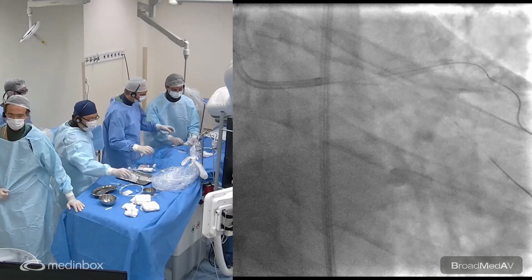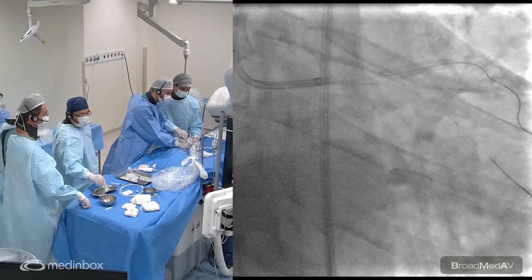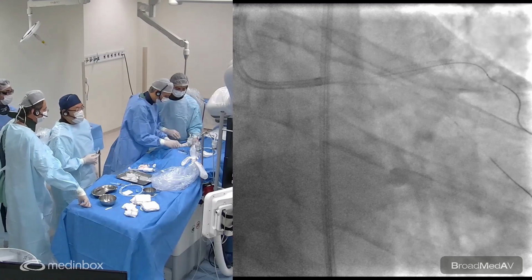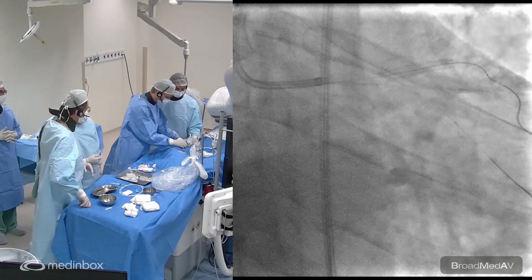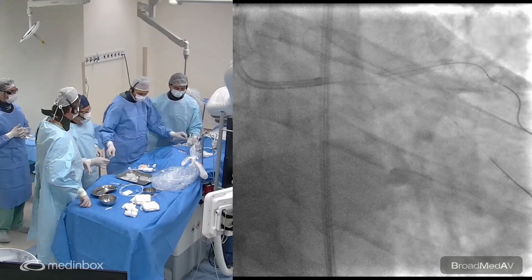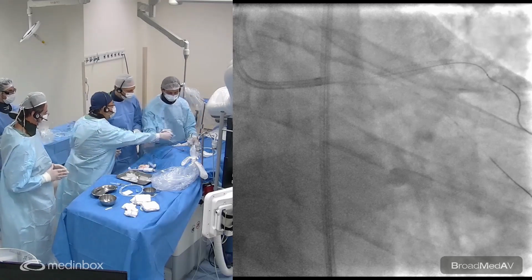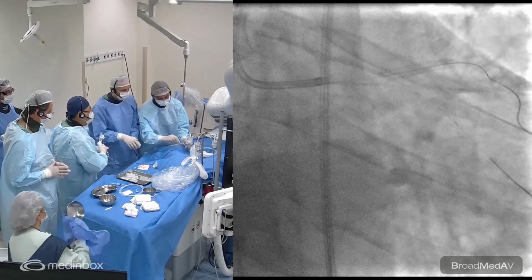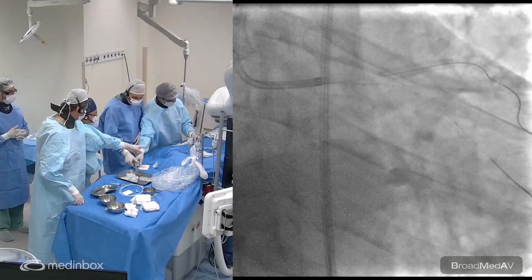Now you are bringing the balloon back and take a look. So do you usually prefer to use adenosine? Or even nitro, if you have a low blood pressure, or over 90 or 100, or to use a small balloon to break this spasm? Do you use this technique? We do use this technique, and we can definitely use that. I think we can try nitro first, a dose of nitro.